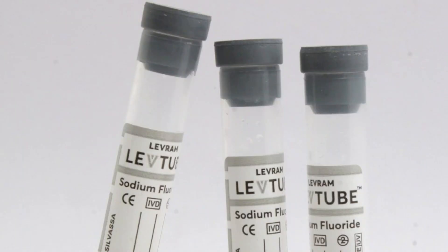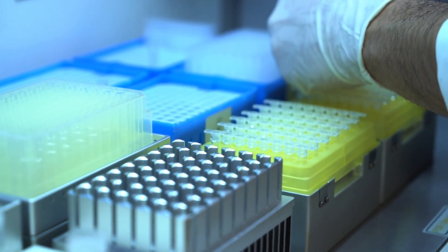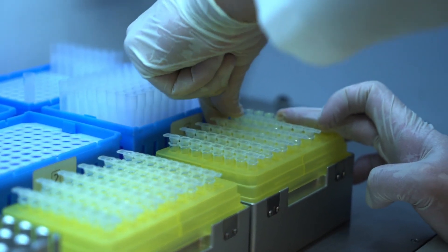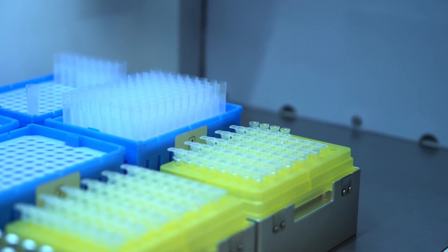Finally, the grey tube. This one contains sodium fluoride plus potassium oxalate. It's used for blood glucose testing because the fluoride stops sugar levels from changing after the sample is collected. Super important for accurate diabetes testing.